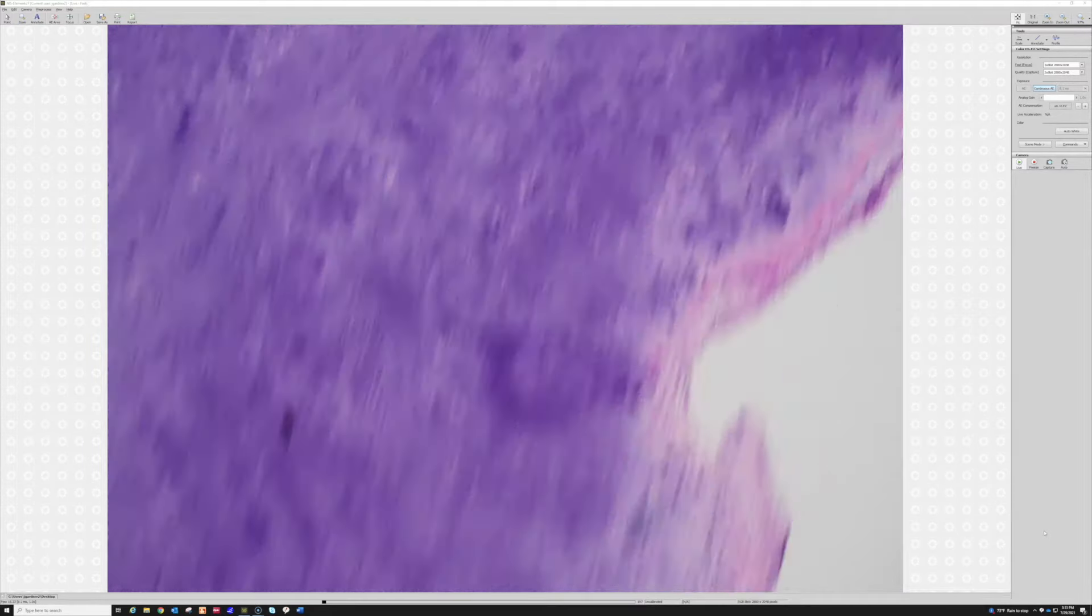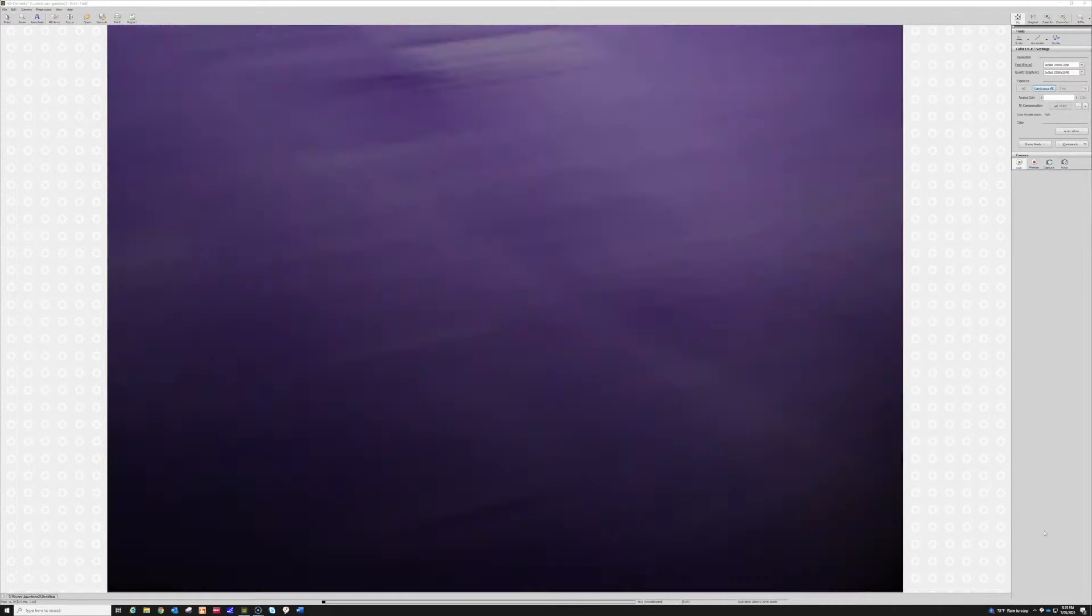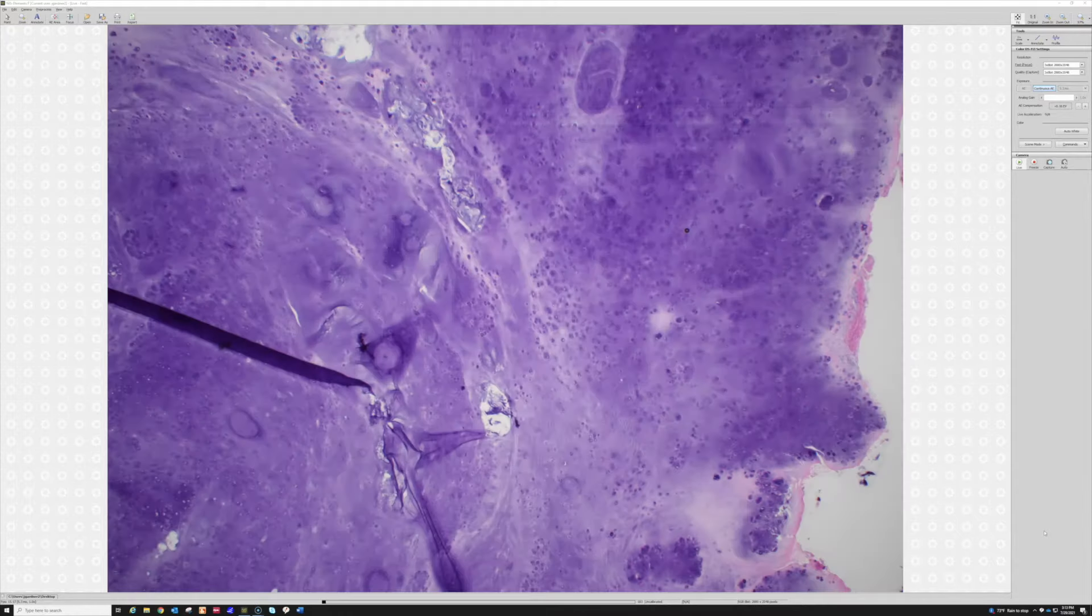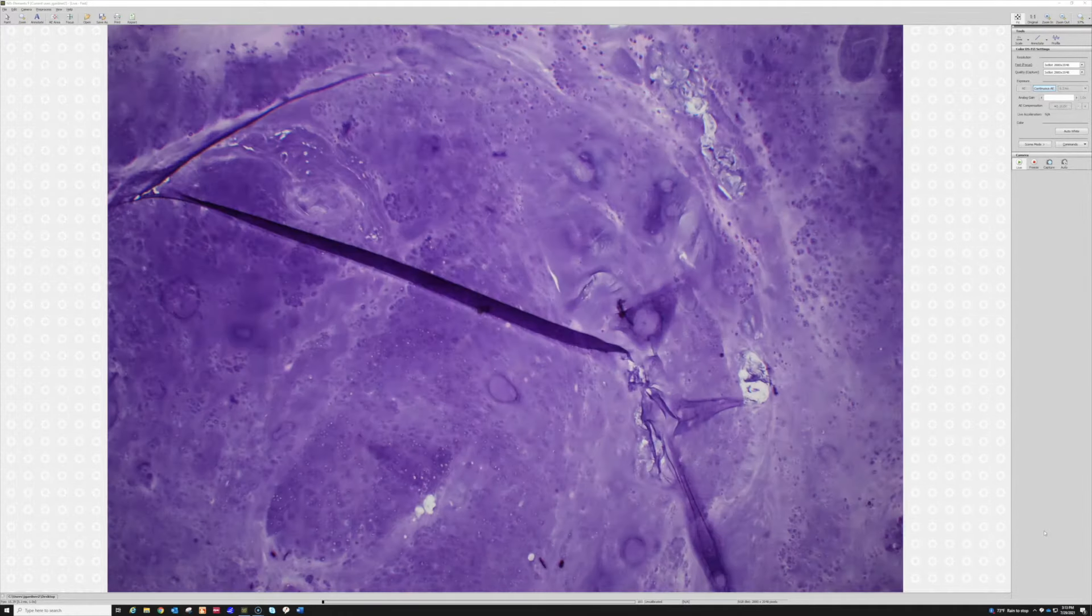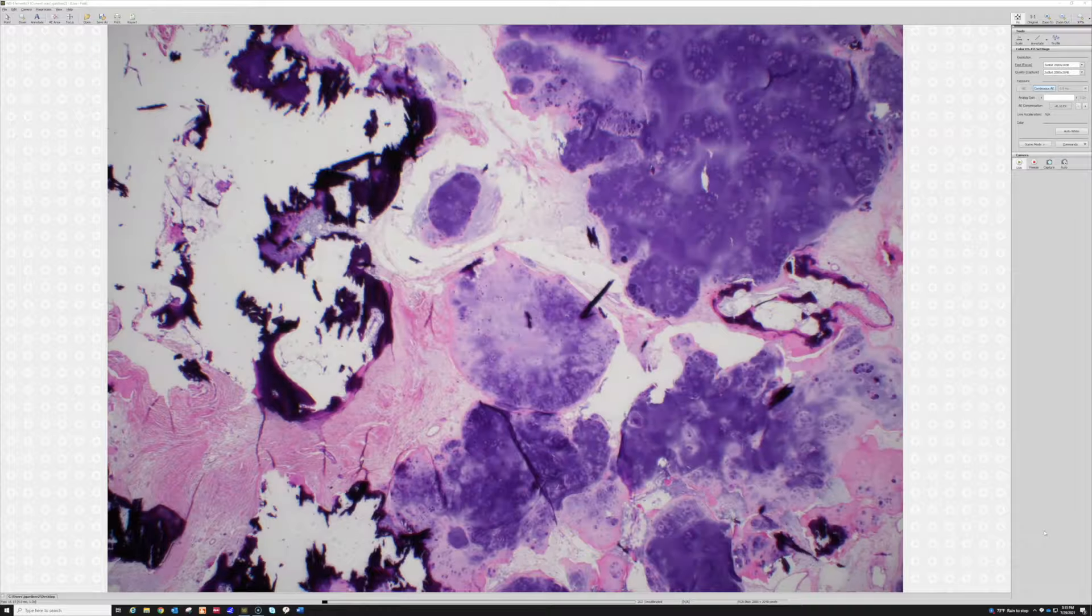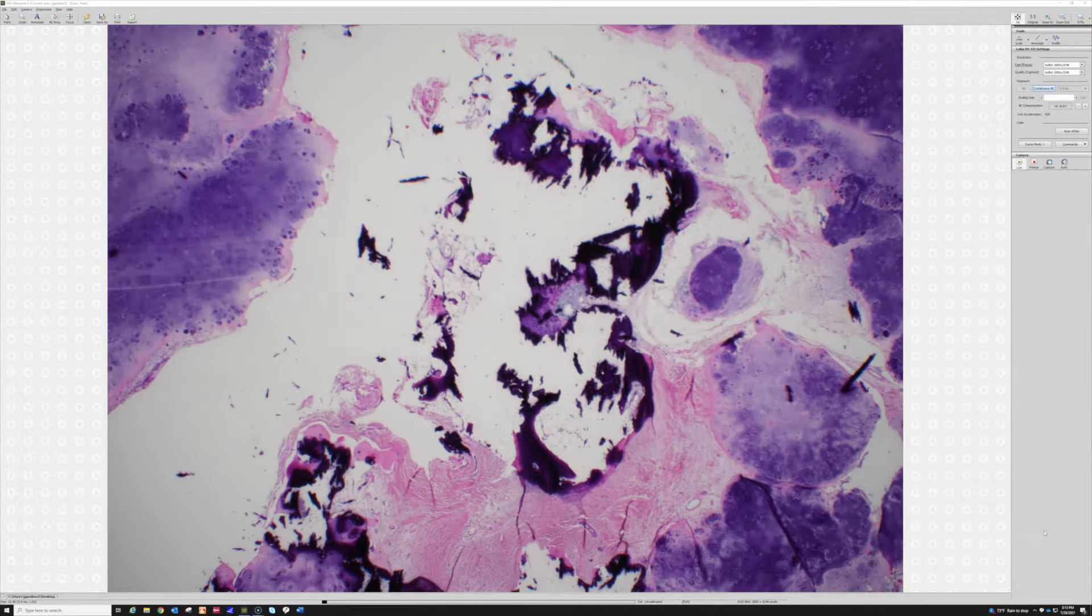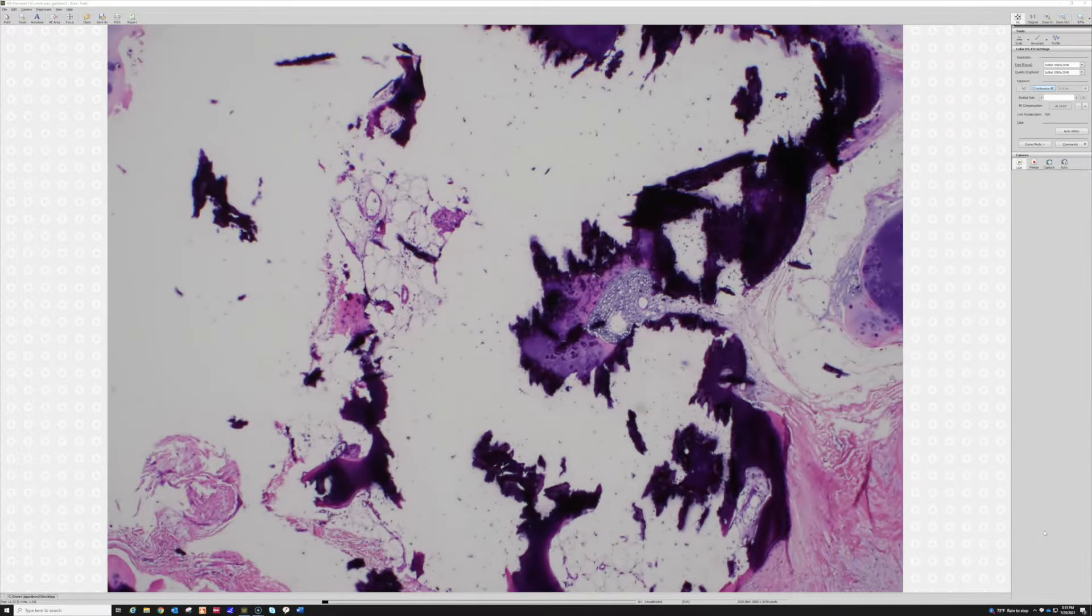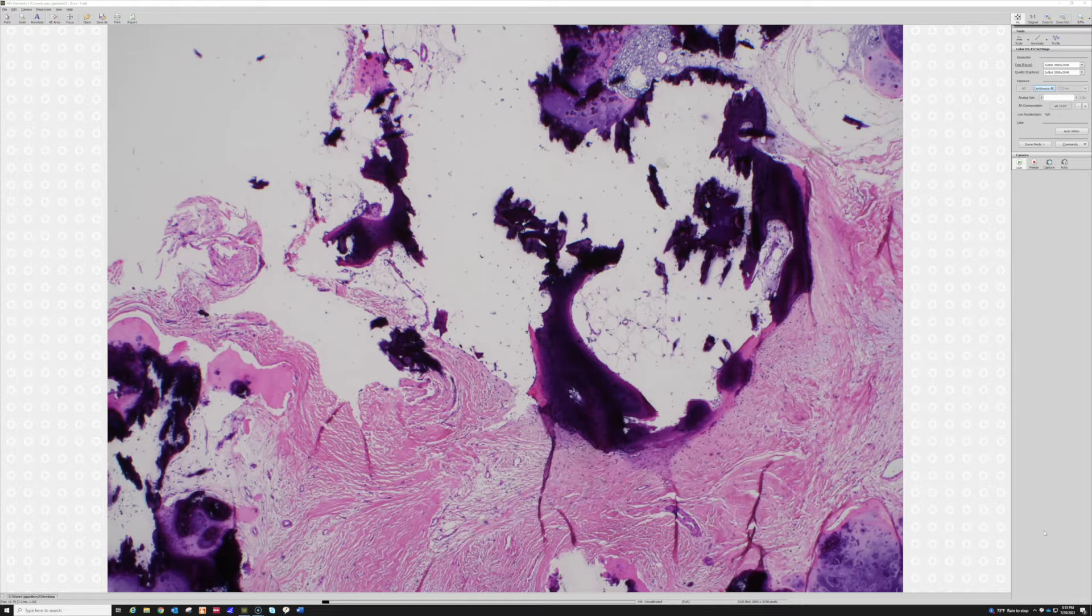But this one worked out, and I think part of why it worked out is that a lot of times we see cartilage in bone and it really messes up the sections. We got a couple folds there. There are some little bits of bone here, but this was actually a lesion in the soft tissue and the synovium right around the knee joint, not involving the bone.